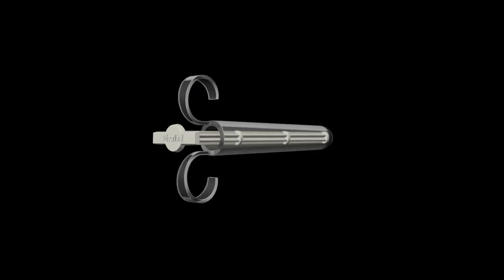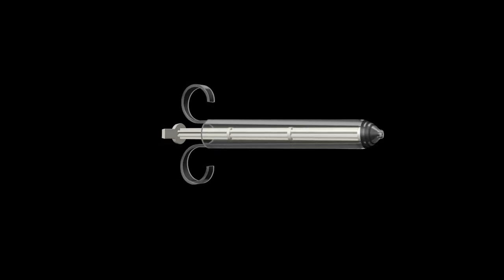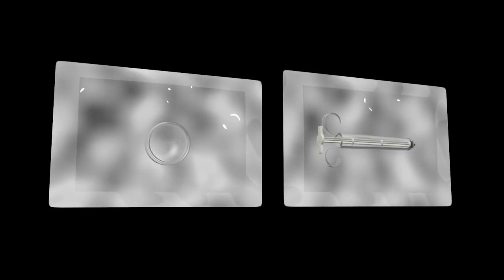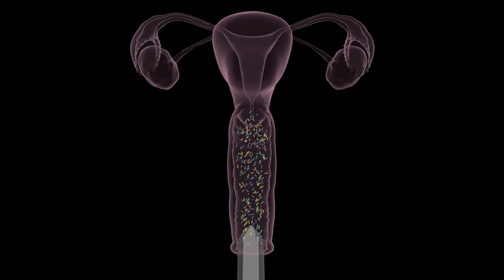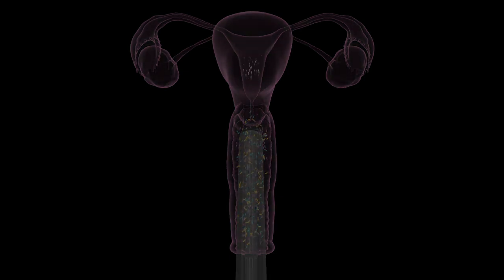PherDal's solution revolutionizes the insemination process by combining the sterility of the clinic with the at-home capabilities, privacy, and comfort of home insemination. PherDal is the only FDA-cleared, 100% sterile insemination kit. Our patented sterility protects your microbiome, while our longest on-the-market syringe delivers sperm directly to the cervix, bypassing the microbiome entirely. This innovative approach ensures over 90% of the sperm reach the uterine opening, maximizing the chances of conception.